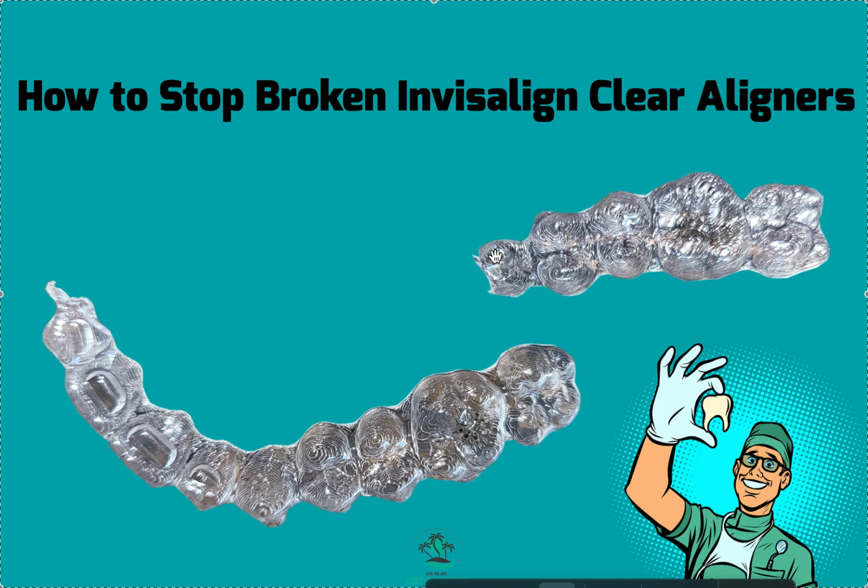Obviously, if you're grinding a lot or wearing down the aligner, or you're wearing it more than a week, which you probably shouldn't need to if your treatment plan is done right and if you're being compliant, it can also wear it down. So anytime you're having a random breakage that's a one-off, probably not a problem. You could order a replacement aligner, or you can submit for warranty fit if they didn't save their old aligners.